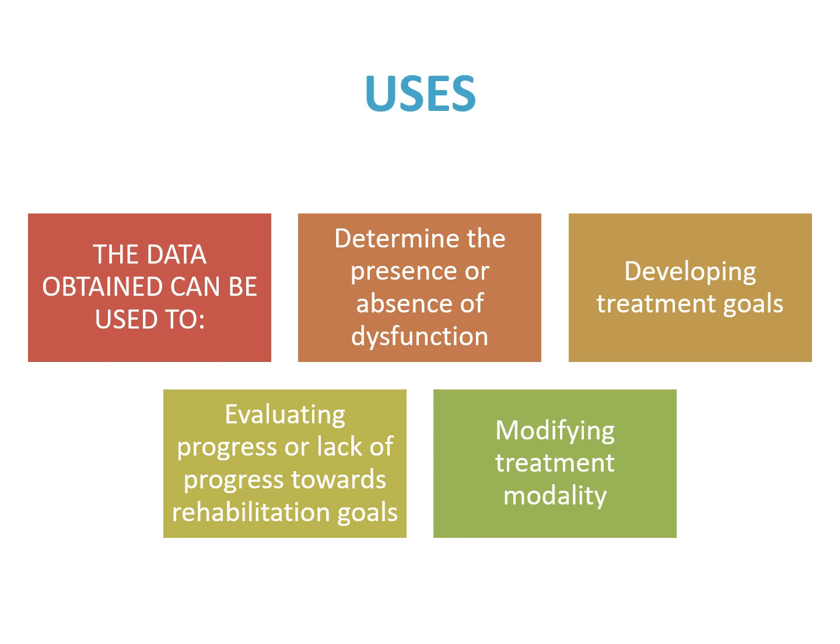This range of motion readings will also help us in developing the treatment goals. It will help you in chalking out the goals for the patient, how much you want to achieve in this patient, how much improvement you want in this patient. So you can formulate your goals after getting the data of the patient.